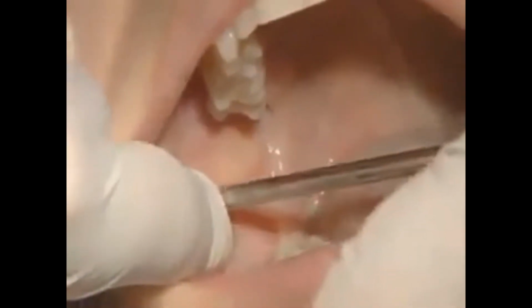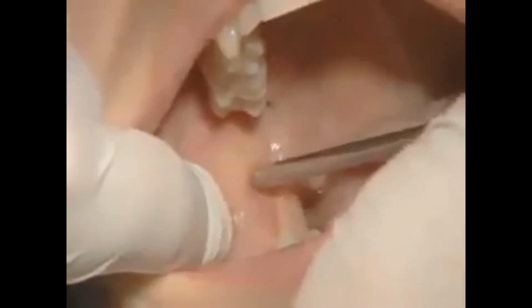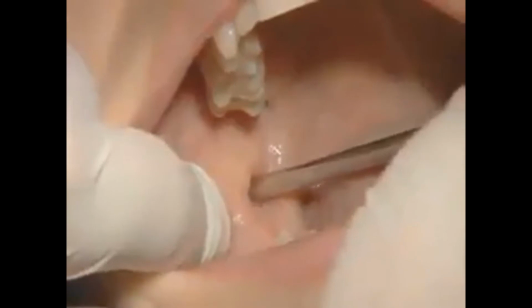The medial border of the depression is the pterygomandibular raphe, and again the needle insertion will be within that depression, lateral to the raphe. The height of insertion will be roughly the midpoint of your fingernail, anywhere from the midpoint to the height of your fingernail, and that determines the correct height of insertion.